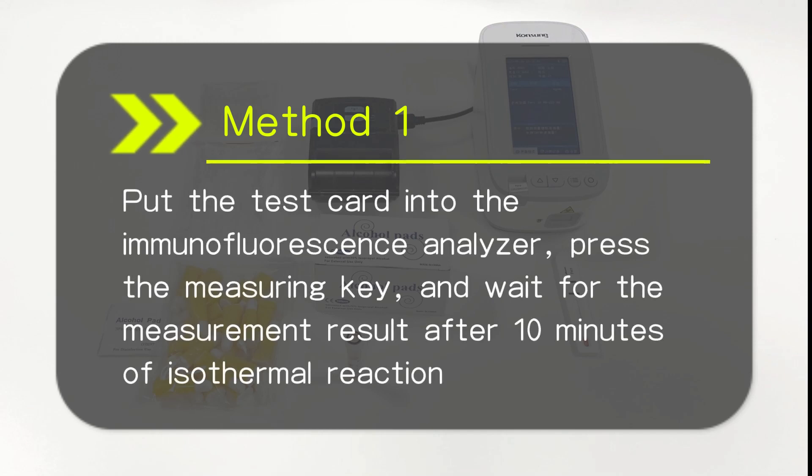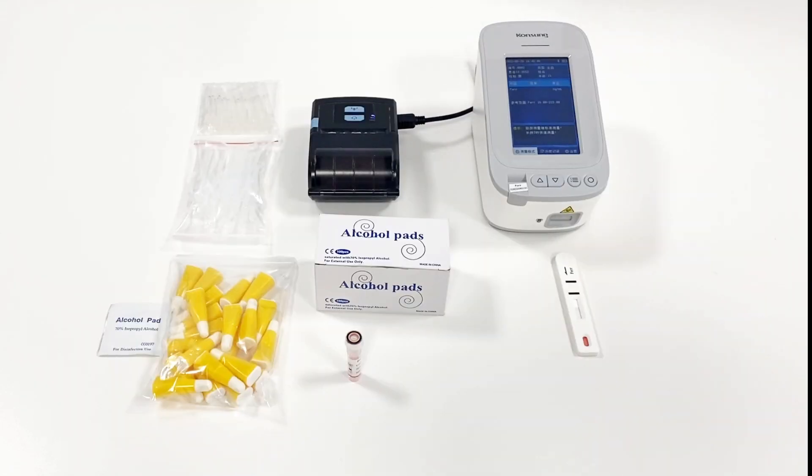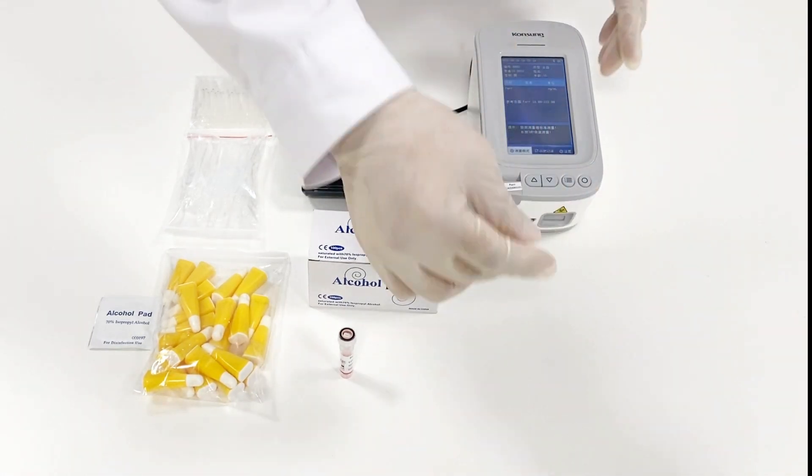Insert the test card into the immunofluorescence analyzer. Press the measuring key, then wait for the measurement result after 10 minutes.